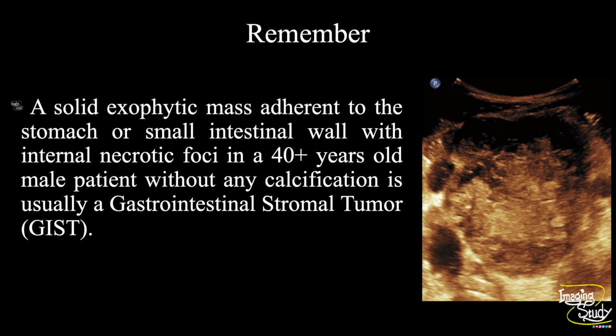Now the take-home message. A solid exophytic mass adherent to the stomach or small intestinal wall with internal necrosis in a 40-plus-years-old male patient without any calcification is usually a gastrointestinal stromal tumor. Contrast-enhanced CT scan is an excellent procedure for further confirmation.